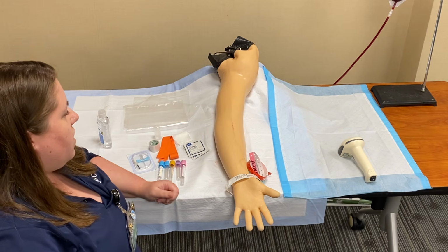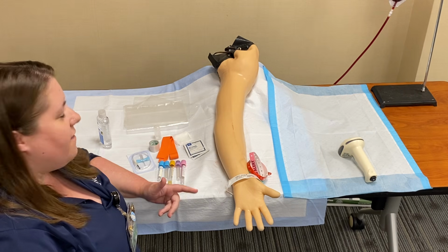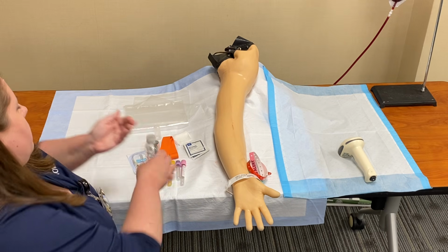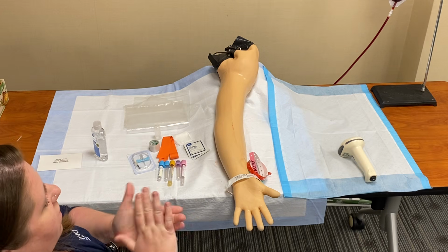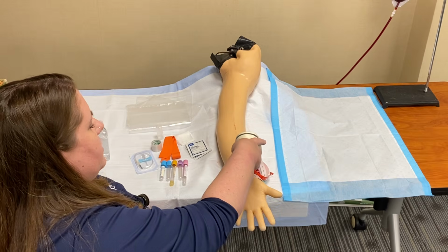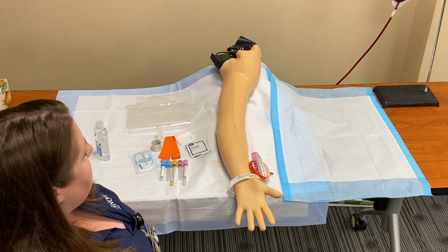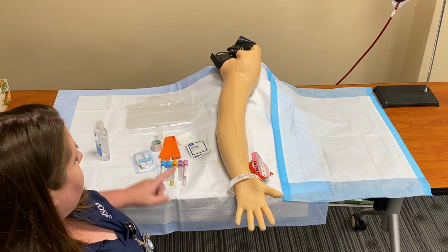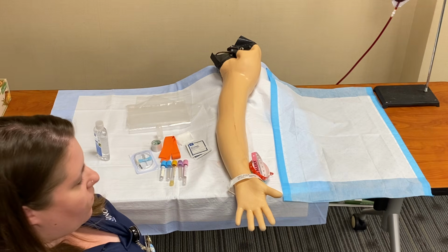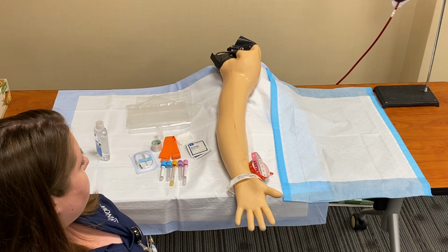With phlebotomy, when we do our Ask, Ensure, Verify, we have an additional step to make sure that the labs that are ordered are in the computer. So I'm going to head over to the computer and log in with Soft ID. Once I log in, I scan my patient's bracelet, beep, to pull up her chart in Soft ID. There I can see all the tests she has ordered. I need to make sure that the tests we're drawing are in there. If they're not, I'm going to call the nurse and let them know, because I cannot draw blood for tests that I don't have in Soft ID. So I know she's good there.